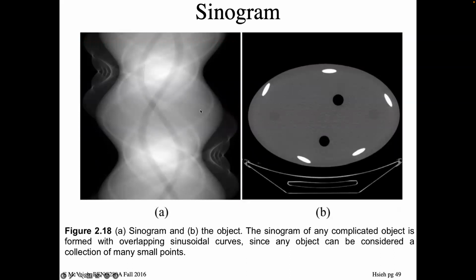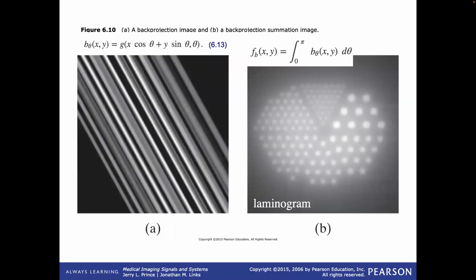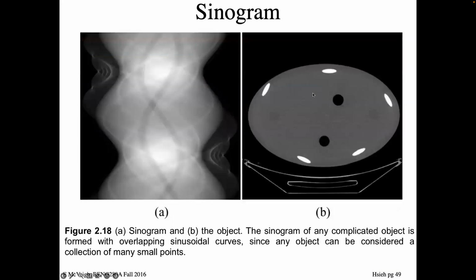So here's a simpler sinogram. We had a very complex object with all these dots. This one's simpler, it has fewer dots. But you can see in the sinogram as we go, this looks like we're going through 360 degrees here. The two major dark features, you can see the sine waves that they paint out in the sinogram as a function of viewing angle. So this is view angle this way, and this is position along our detector this way.